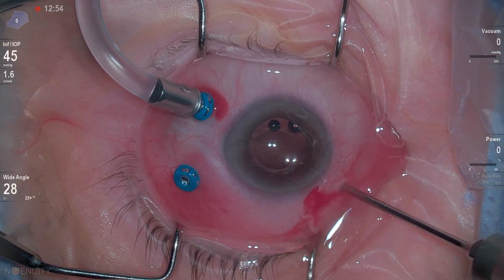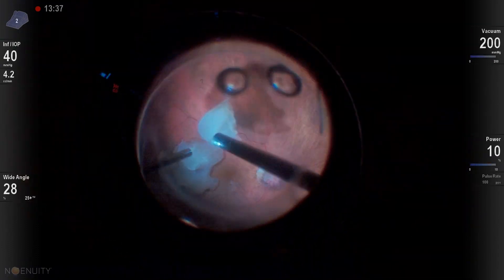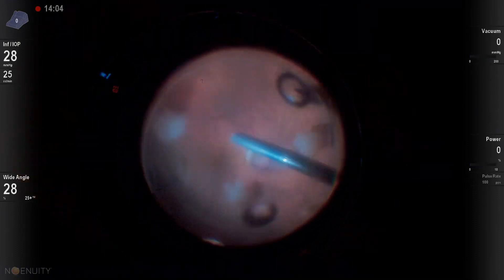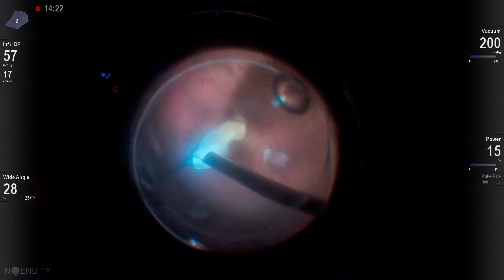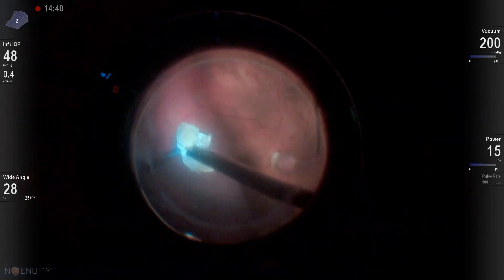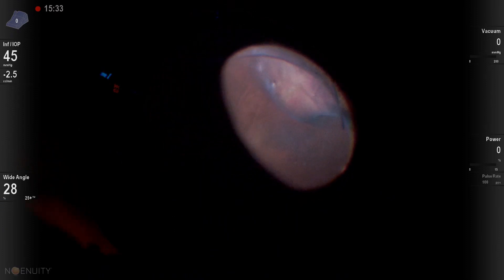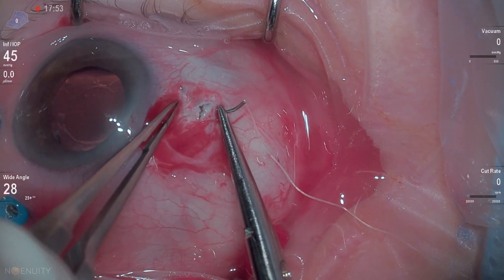When you have too tight of a seal and too much power, you can get a fragmentome burn. I'm using the frag handpiece first on aspiration only to lift the pieces of nuclear material up off the back of the eye, and then engage the frag power. If you're having trouble keeping the nuclear fragments on the tip of your fragmentation handpiece, it's because your power is up too high. Start at a low power — 10, 15 — and increase if you need it. The number one problem with keeping nuclear material on the tip really comes from having the frag power too high.